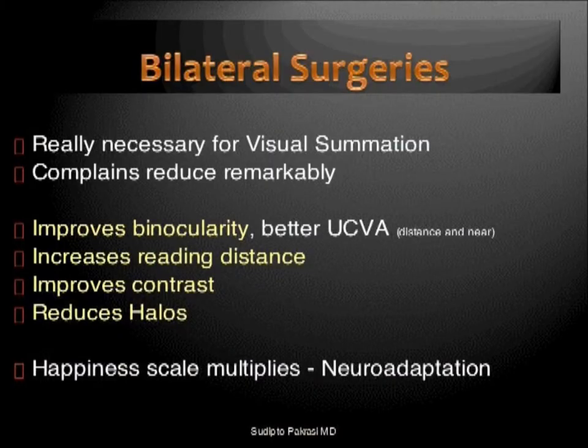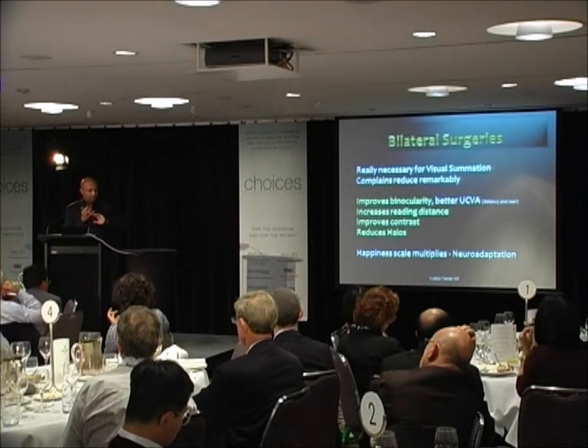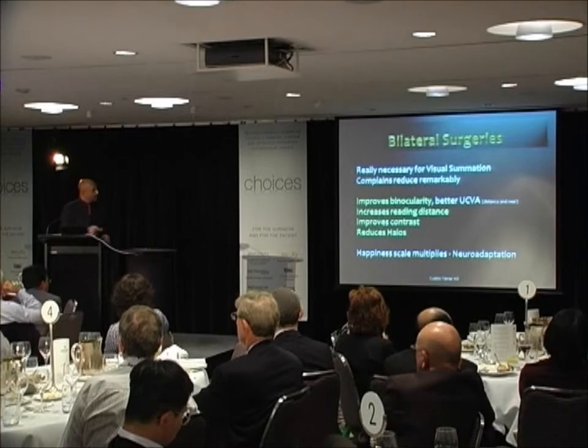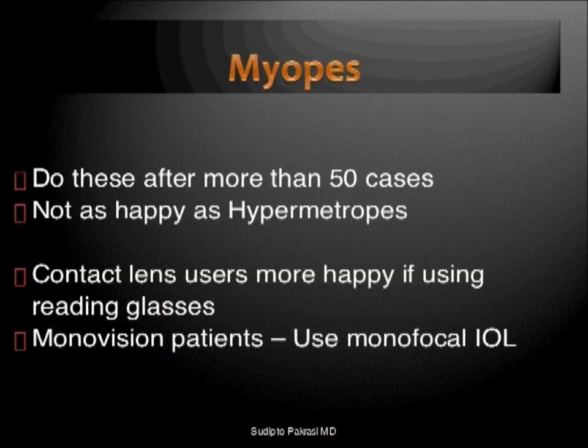Bilateral surgeries, this is one of the most crucial aspects of this lens. If you have a patient and do not bring the other eye, he is not going to be happy. So bilateral is something which, in my first couple of patients, I was doing after 1 or 2 months, and they used to come back with complaints after the other. We have now been doing most of the cases within a period of 1 week in the two eyes. Richard Packard from the UK does both the eyes in the same sitting. Now that's not a very good idea, because if you are surprised with one aspect of your surgical procedure, you may end up with some refractive error, and you don't want that to happen in both the eyes. So neuroadaptation really works with this implant.